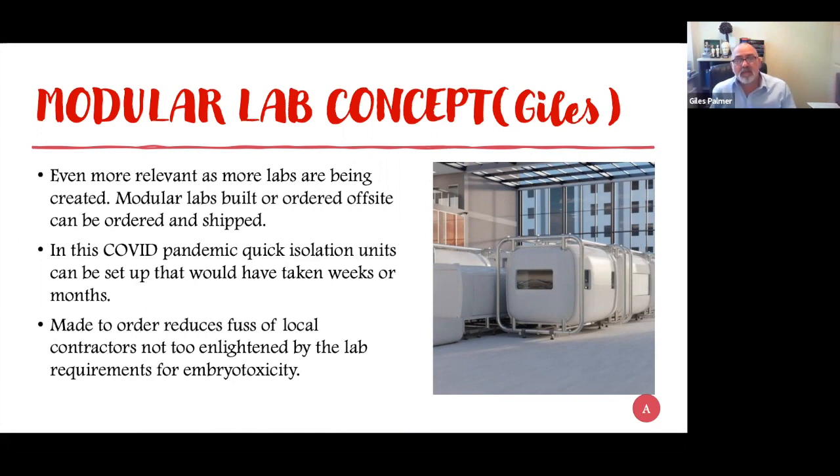And the reason I think they could be more applicable is that when I'm doing the work, and I've traveled the world looking at labs, often there's a lack of expertise locally, or even a lack of material. And again, this is for many questions after this about what materials you use in a lab. Well, this can be taken away in a way that we can now use modern manufacturing techniques to actually order your lab off-site and have that shipped there. This could be not only for developing countries, but even now in countries where real estate, where actual space, is very, very expensive to have a lab.